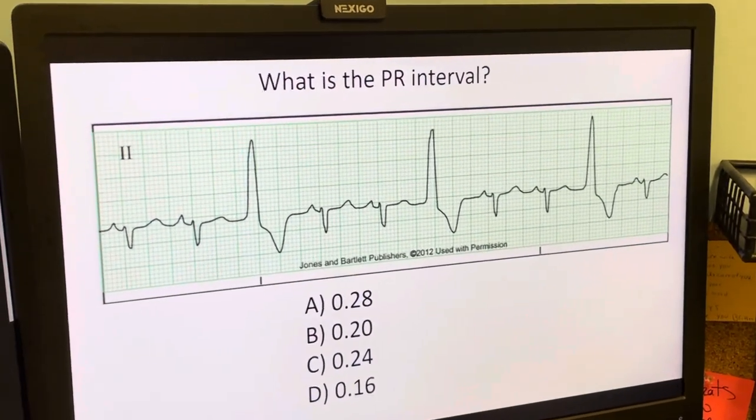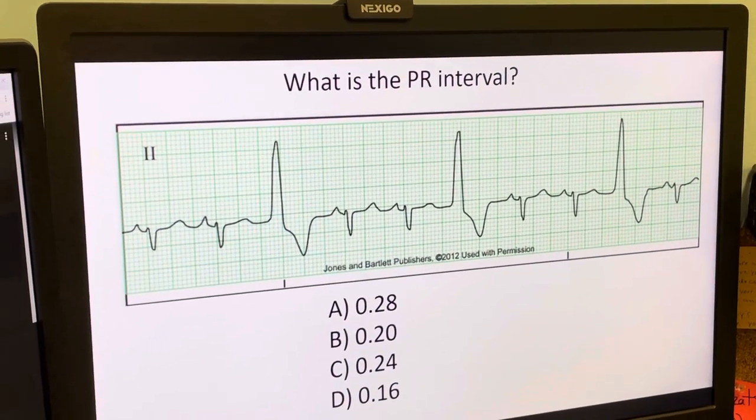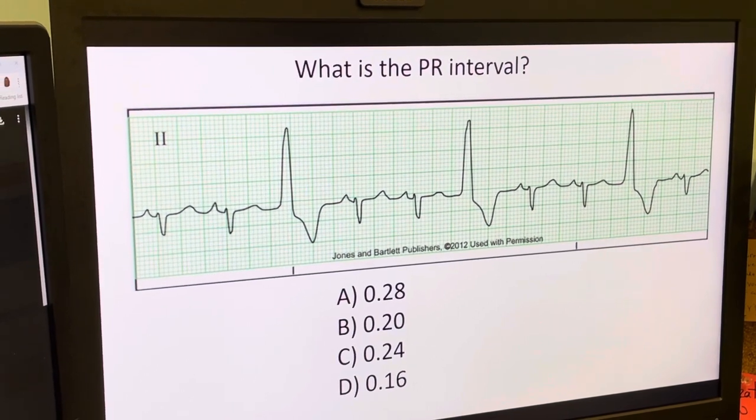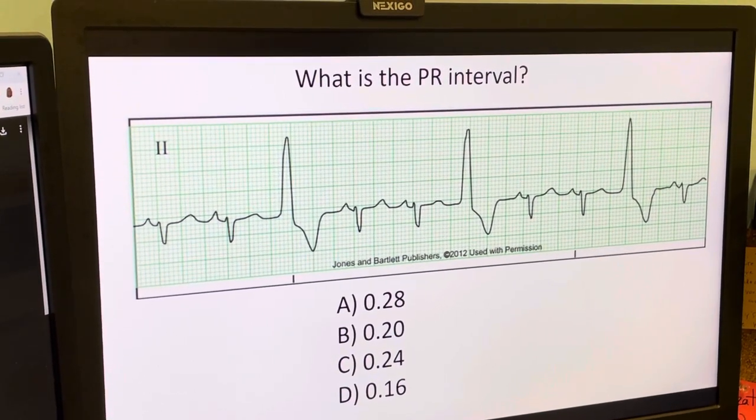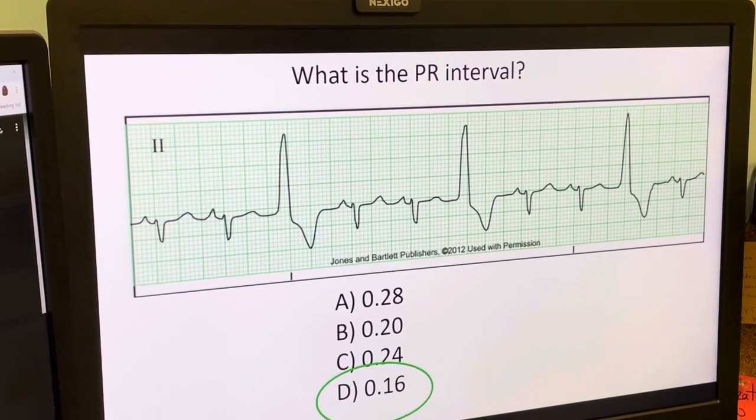I could also measure a couple other PR intervals and take the average, maybe the average is closer to 0.16. But in this case, closest answer to 0.12 is 0.16. I'm going to select that as the correct answer for my exam.